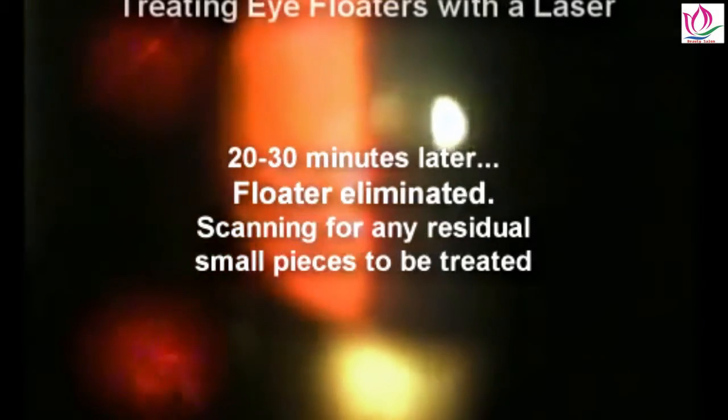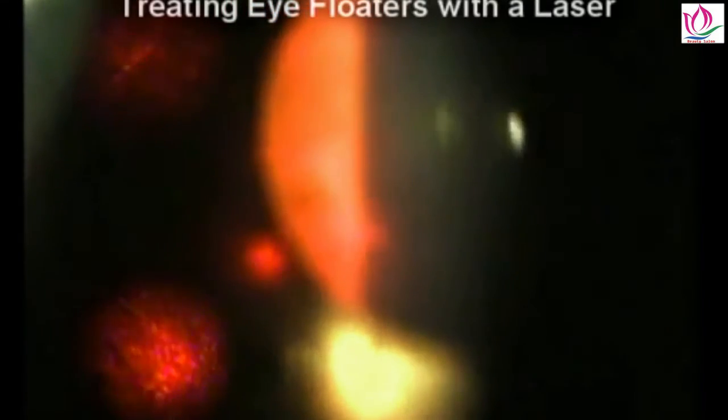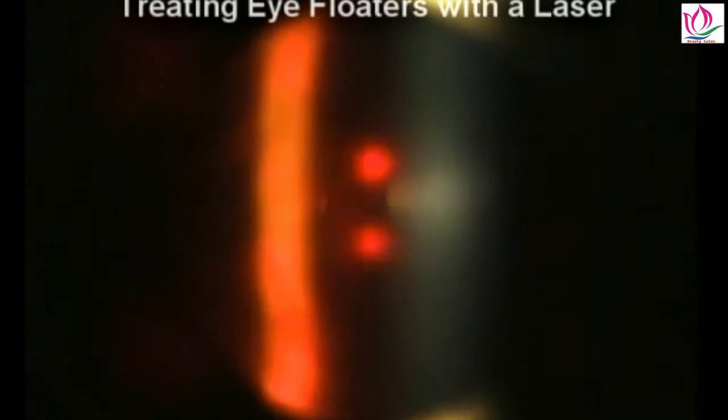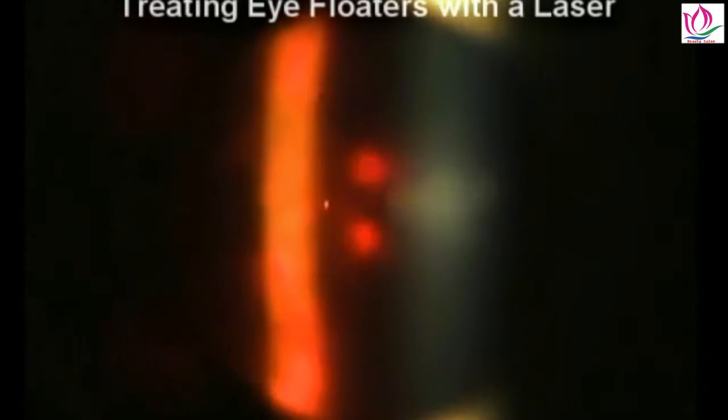So now we've jumped ahead here. This is probably after 20 or 30 minutes of treating, and I've switched to a different lens. It has a little bit wider angle. I have a little more depth of field with this lens. And I'm just going back and finding small little fragments that were left. These are some small little pieces that I'm hitting here. You can see a couple little bubbles going away.